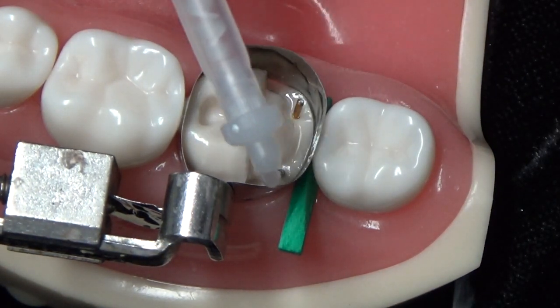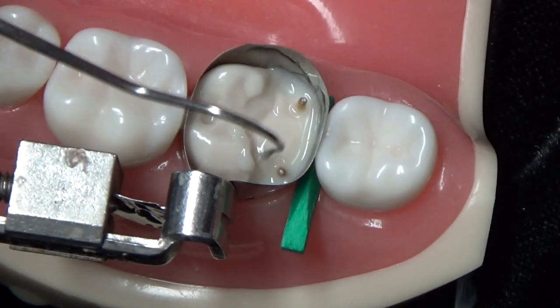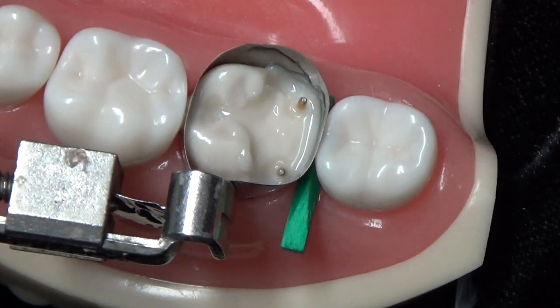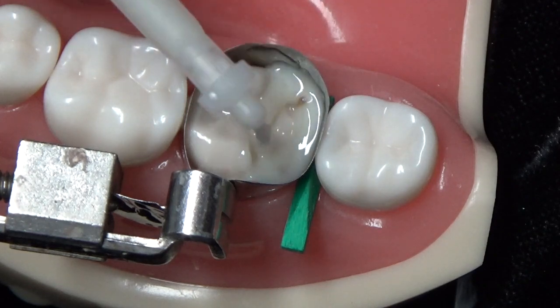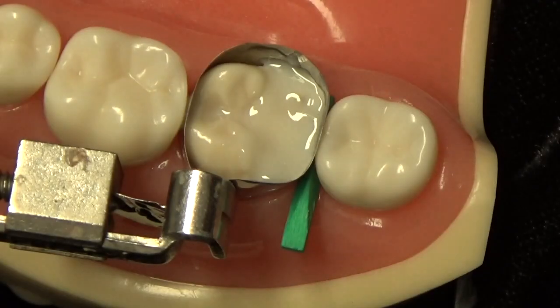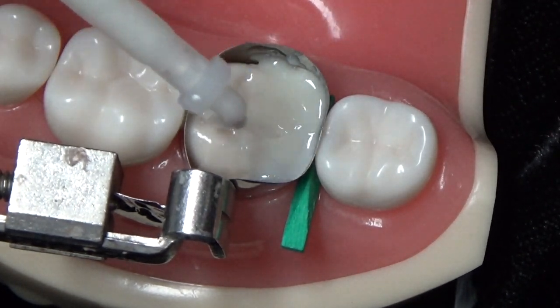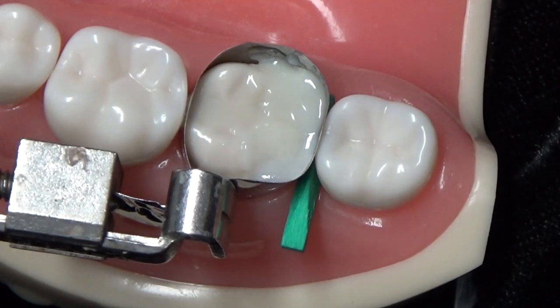After that, we'll place the core buildup material. Most composite-based core materials come in dual cure, but I like to cure it by layers to keep better control. I use the same procedure for each layer and like to use an explorer to spread it around. The whole idea is to avoid any bubbles — you'd be surprised how often a bubble will appear in the buildup when you start prepping for the impression. Placing material in layers minimizes this. Once cured, we remove the wedge and the matrix band.